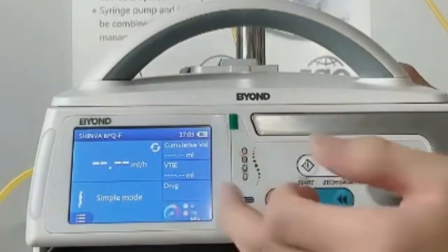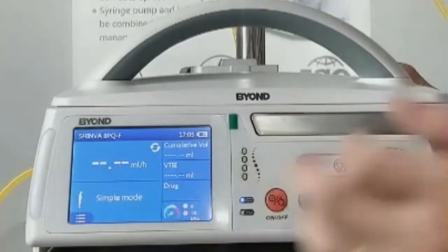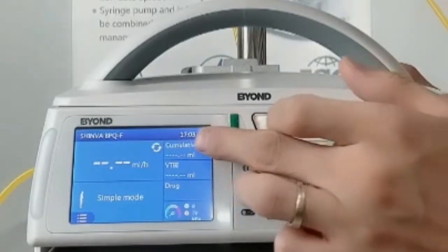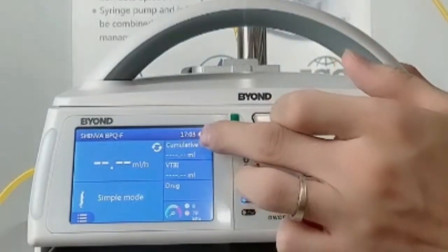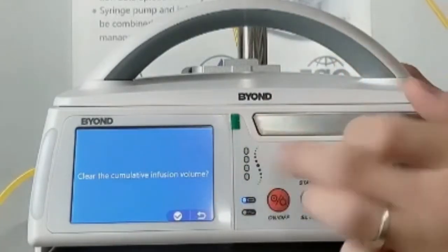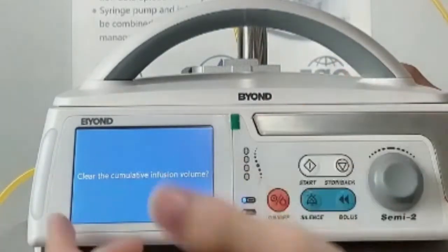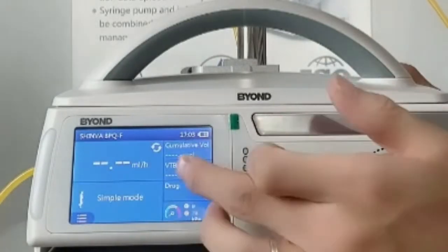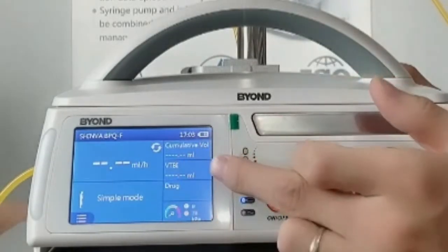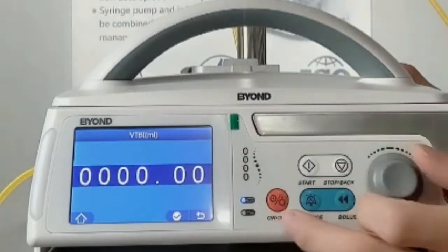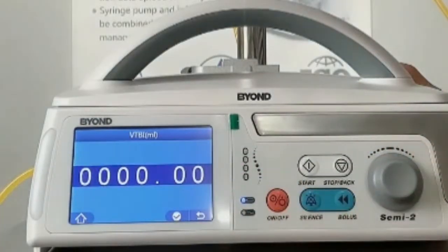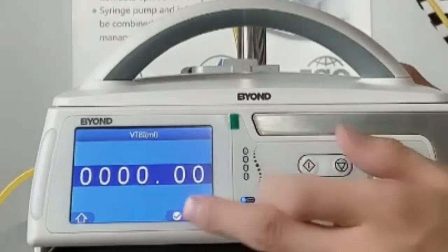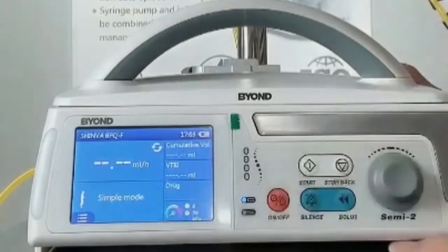This is the working mode. This is the cumulative volume — you can clear the volume value. And this one is the VTBI volume; VTBI means the volume that should be infused. You can set this.